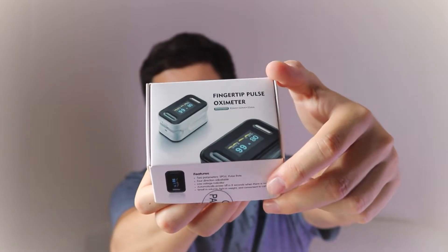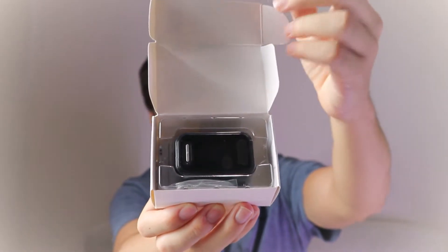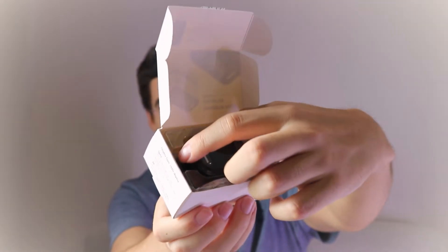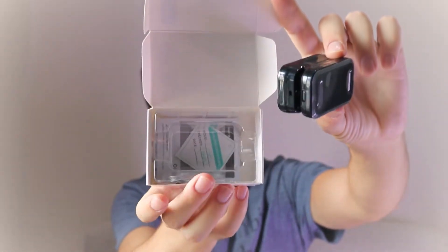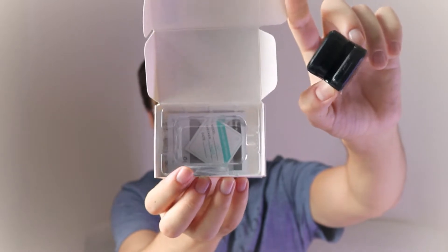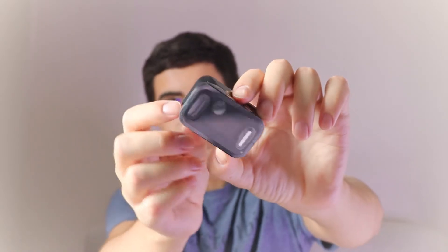Let's open up the box and see what we get inside. When we open up the box we find three things: the pulse fingertip oximeter, the user's manual, and a little lanyard rope that you can tie to the oximeter so you can carry it around easily.